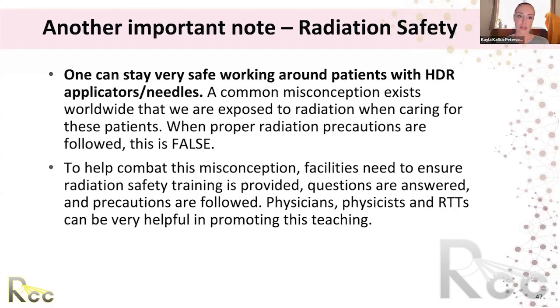When proper protocols are followed, this is false. And we wear dosimeters, we have vaults. If there's any concerns, of course, there's always breaches in this stuff, but as a science, as a discipline, you can safely work around HDR patients.